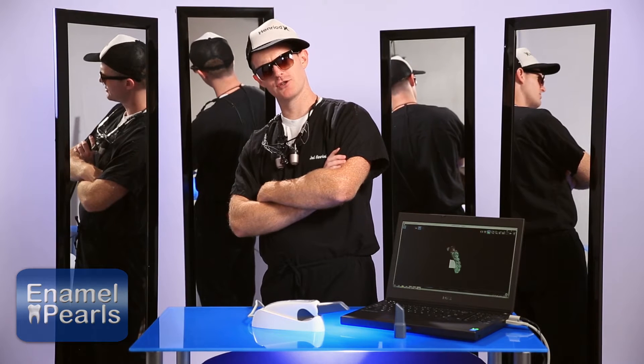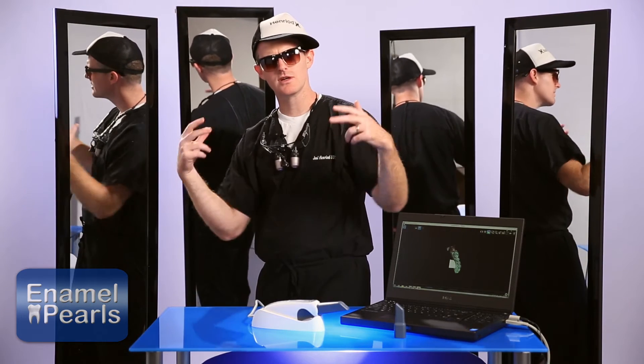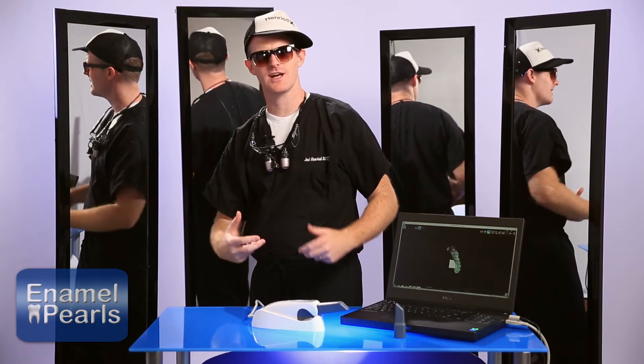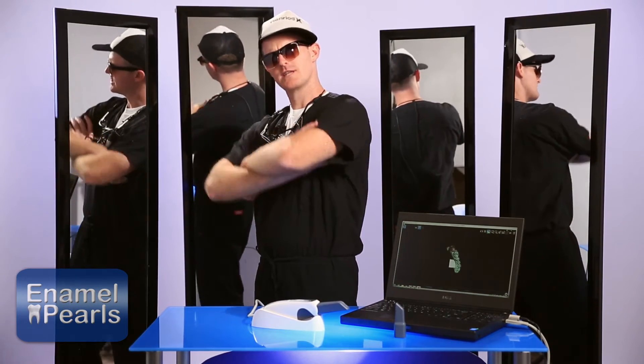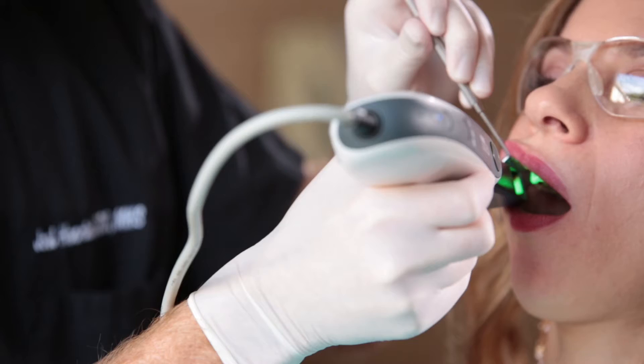Have you ever noticed how when you take a picture of yourself in the mirror the flash bounces back and blinds you? Not only that, when you look at the picture the hotspot — the area where the flash is reflected — is overly bright and washed out. The same concept applies to intraoral scanners when scanning reflective surfaces.